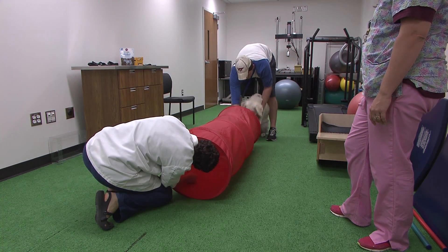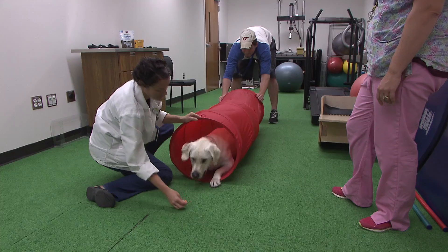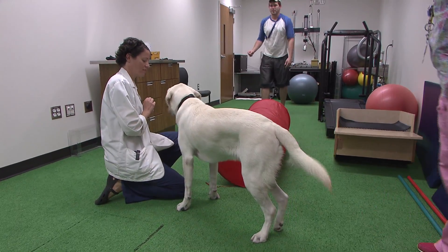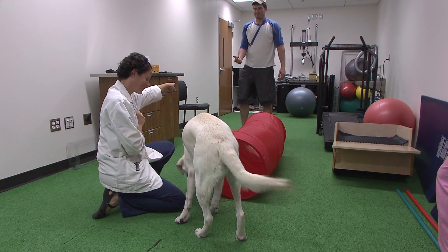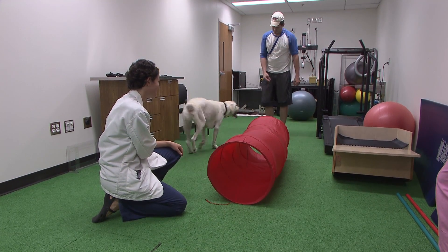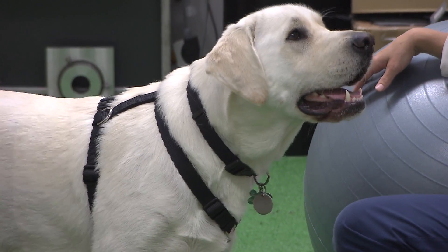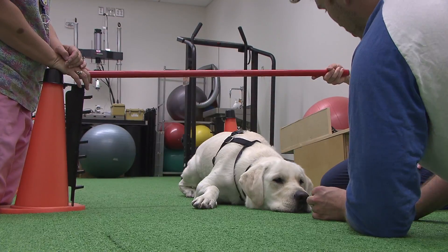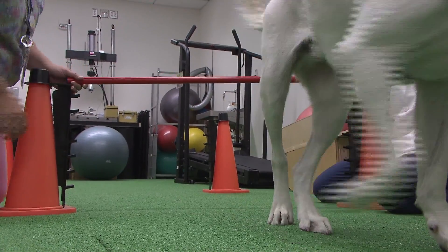We did tunnel work to get him to use more of his active range of motion, because he tends to hold that limb up and not use it as much, compensating on his other side. Doing things that require him to bend down and really engage those hind limb muscles. We're trying to adapt those exercises for things they can do at home, like going under tables or chairs, to engage those muscles.